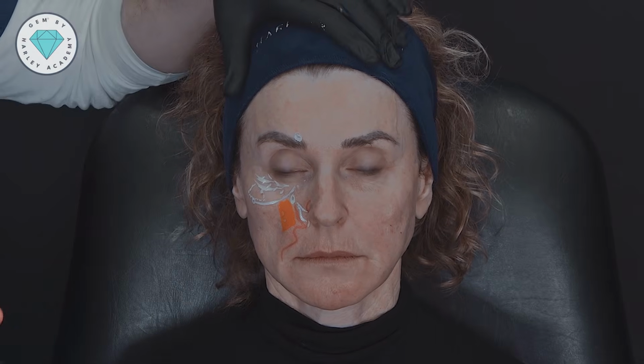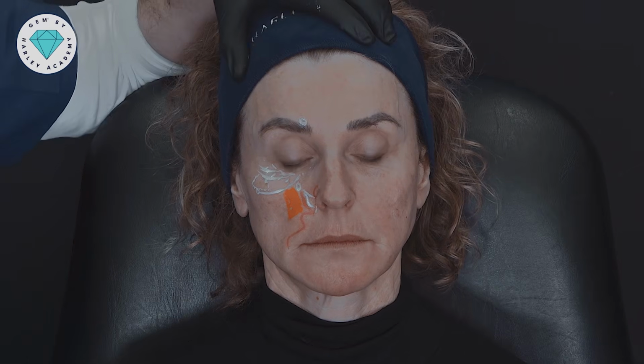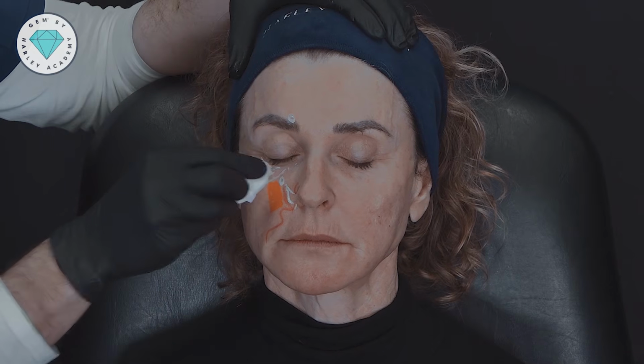So considering those, if we take an injection point in line with the mid-pupillary line or even the lateral limbus of the iris down onto bone and inject slowly with a high G' product, that's how I'm going to maximize the chance of the gel sitting in this deep cheek compartment. That's ideally going to find its position beneath the lip elevator muscles and then avoid those problems of movement on facial expression. So let's clean some of this off, and then let's take a look at the injection technique.